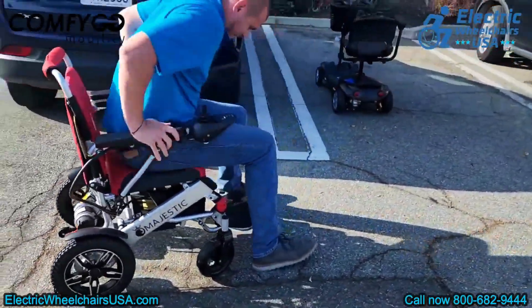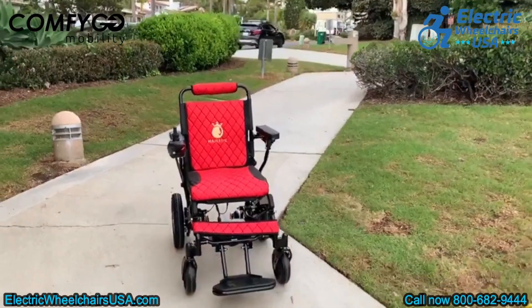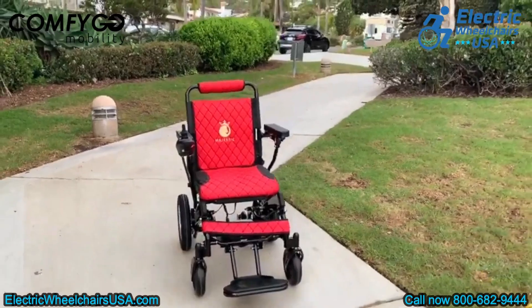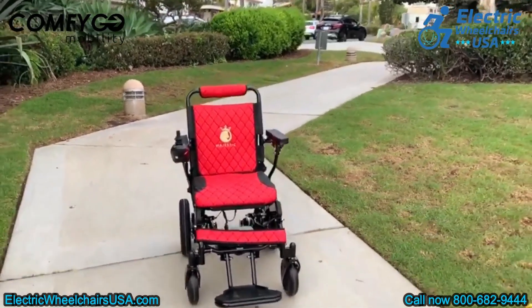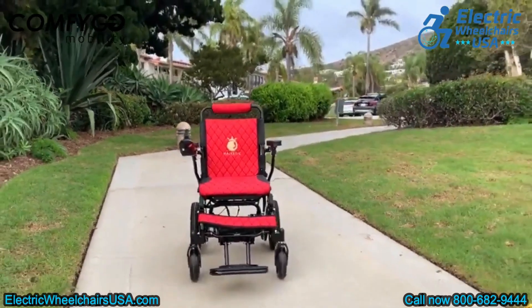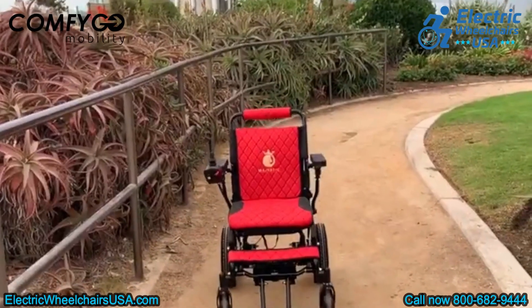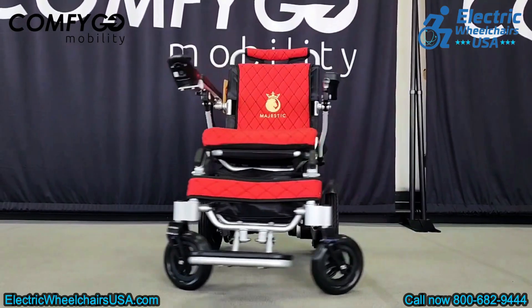Another fantastic feature is the remote control, which lets caregivers operate the chair, or you can use it to summon the chair from another room. The IQ8000 offers two battery options: a 12-amp-hour lithium-ion battery, which is airline approved, and a larger 20-amp-hour battery. Note that only the 12-amp-hour battery is allowed on flights.